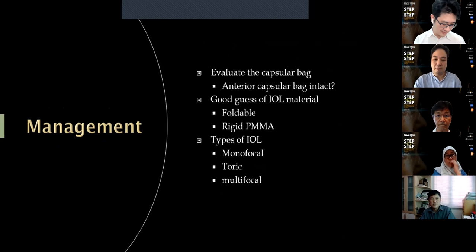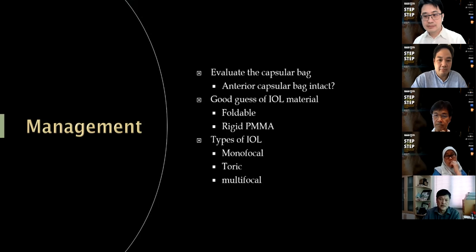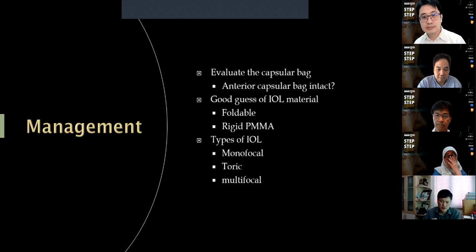Now, I believe the management of subluxated IOL begins from the slit lamp evaluation. I will examine the eye under the slit lamp to evaluate the capsular bag properly, especially if the subluxation is only involving the lens and not the IOL capsular complex. If only the IOL is subluxated, then I will have a good look to figure out whether the anterior capsular bag is still intact. If the anterior capsular bag is intact, then likely I can still implant a three-piece IOL in the sulcus, with or without anterior CCC capture.